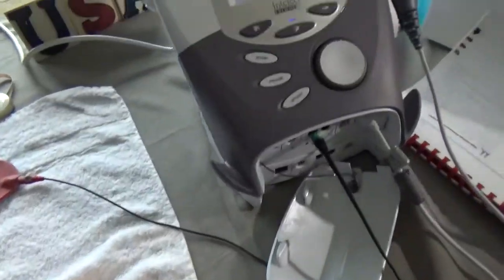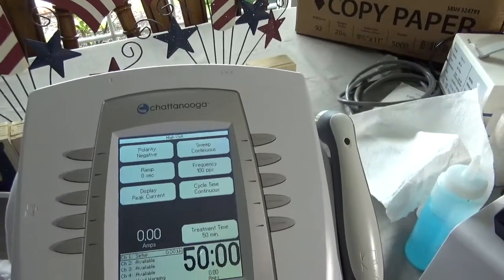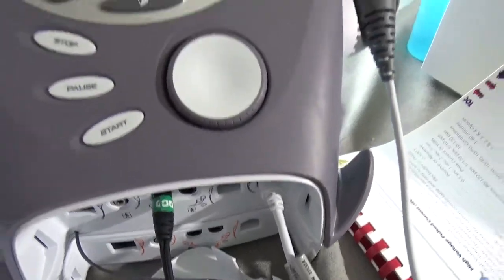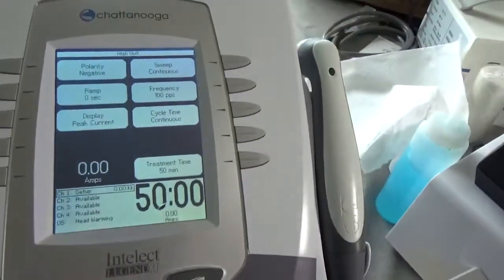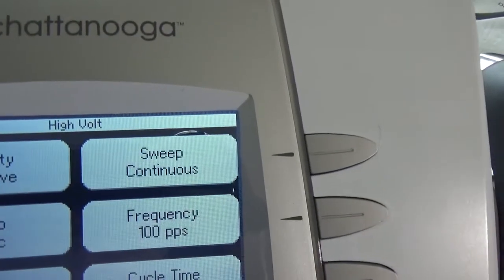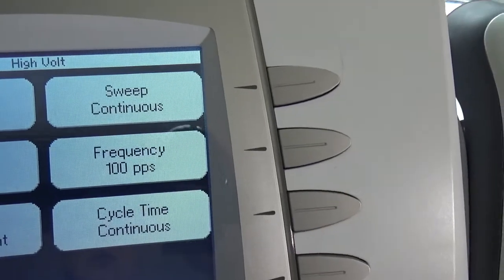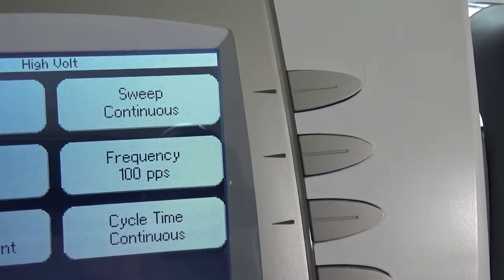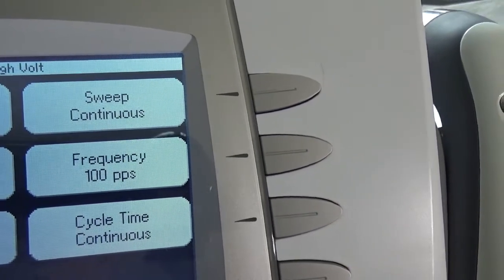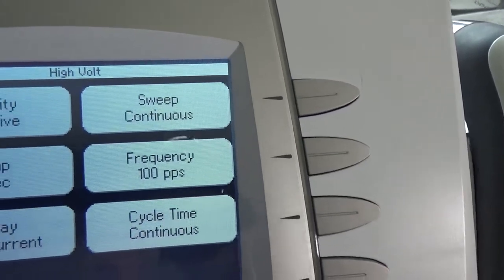Coming over to the Chattanooga unit — I've turned it on with the switch on the back and plugged in one cable for one channel. I have turned it to 50 minutes. It's on high volt. It says it's on continuous, but the nature of high volt pulse current is that it's already pulsed within the machine. The frequency of 100 pulses per second is what the Rose Handbook says to set it on.